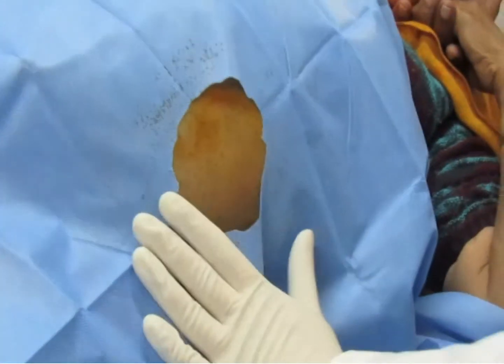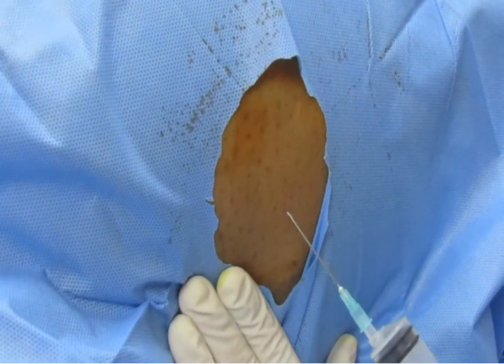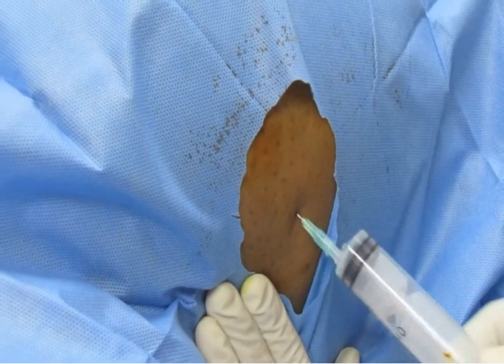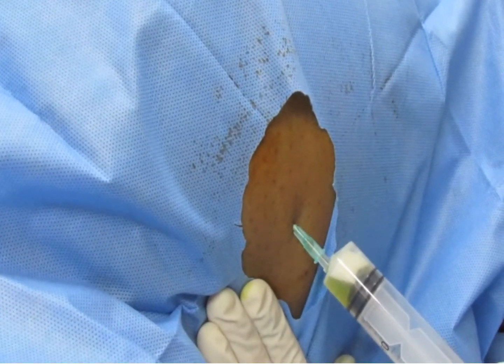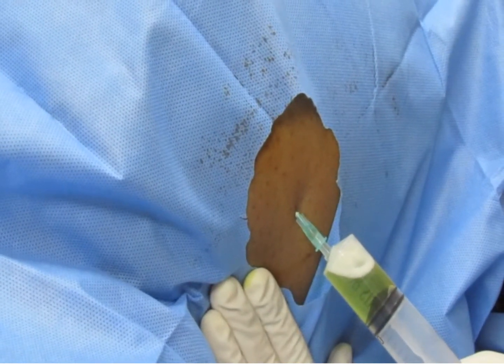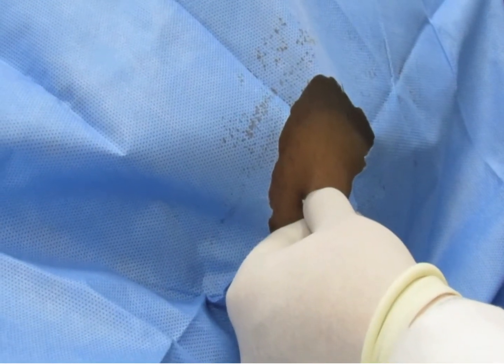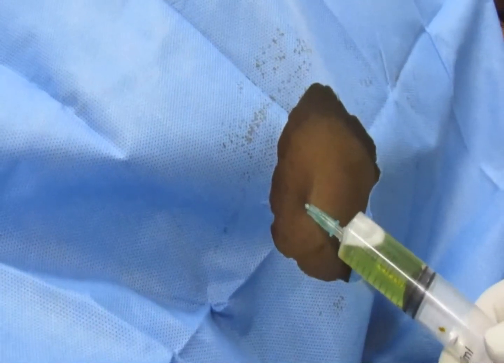To prevent leakage of fluid from the site of needle entry during paracentesis, the skin puncture site should not directly overlie the puncture site into the peritoneal cavity. This may be accomplished in two ways. The Z-track technique is accomplished by drawing the skin 2 cm downward with the non-dominant hand as the needle and syringe are advanced into the peritoneal cavity. Once the skin is released and the needle removed, the skin assumes its original position, effectively sealing the path of needle entry. In the angular insertion technique, the needle is inserted at an acute angle to the skin surface and gradually advanced, ensuring that the skin opening is obliquely oriented to the peritoneal opening.